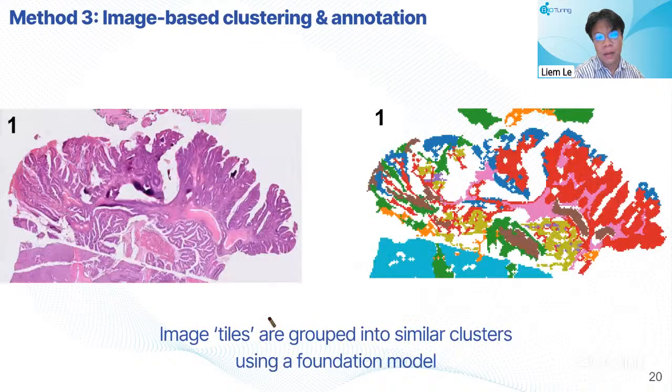So you have on the left the histology section, right? This feature will break it down into different pieces or image tiles. And not only does this feature consider the tiles, but it also considers the neighboring tiles.